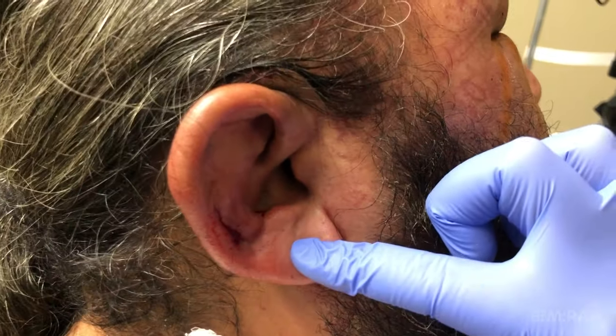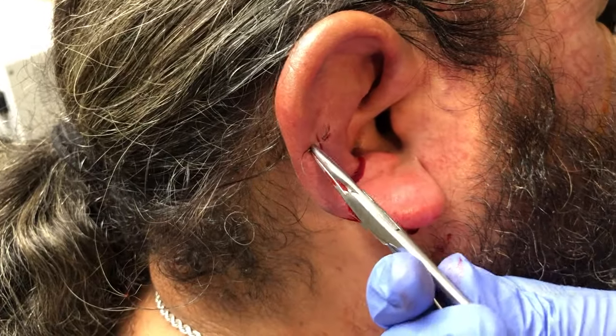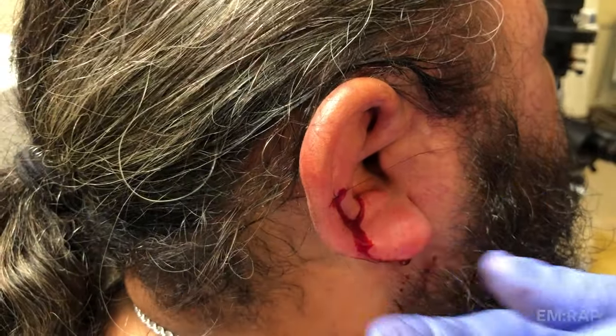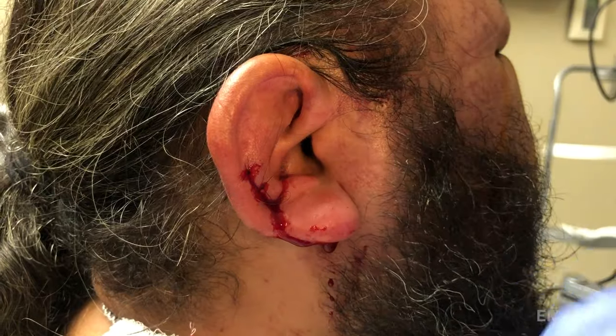Look how much better this ear looks — it's a miracle. Now the final steps are to close your incision and then do the ear bolster compression dressing. This is just a standard closure with 6-0 nylon using simple interrupted sutures — you just need enough to close the incision that you made.